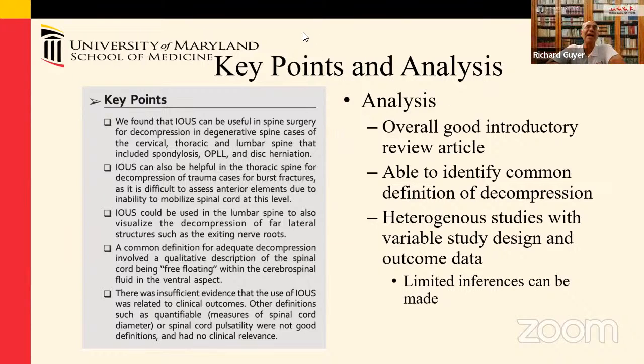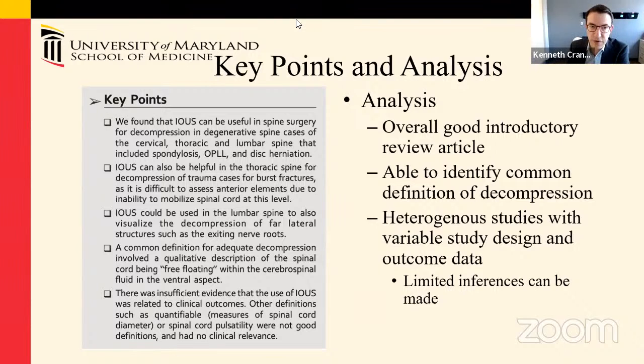Yeah, that would be great if they have that, because that's the question: how much decompression do you have to do? Did you do enough? Do you have to take more? Yeah, for sure.